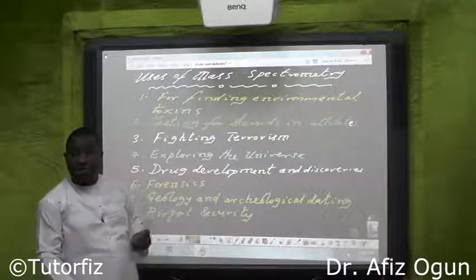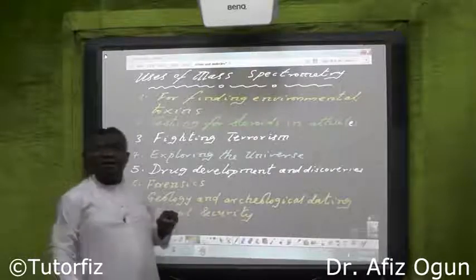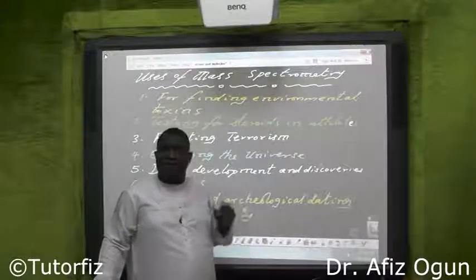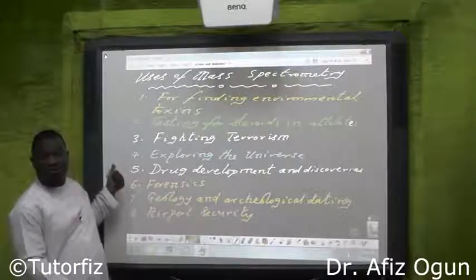When you get the blood or the urine, you want to test the substance there. You want to know if a particular molecule that is banned, that is forbidden for the athlete, is there. You use your mass spectrometry. Mass spectrometer to do it.